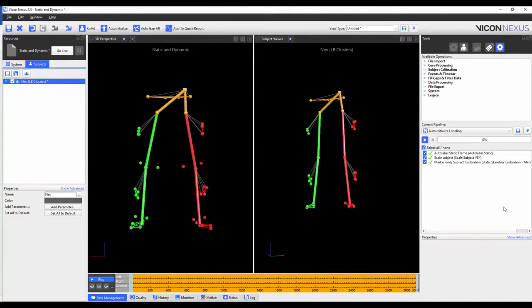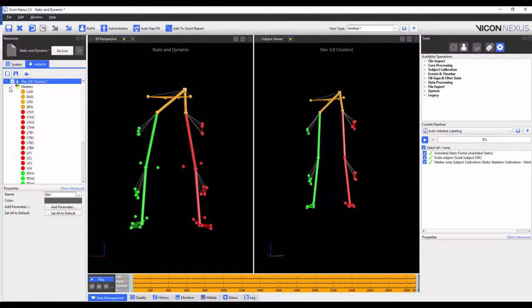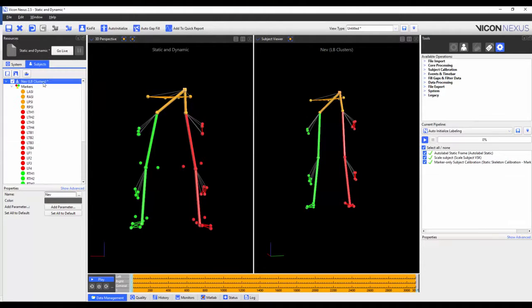When I go to capture my dynamic trials, I don't want these markers to be present on my subject, and so I will be physically removing them from my subject. Similarly, after running the calibration, they are disconnected from the rest of the markers and are removed from the marker list. Finally, I'm going to save the subject.